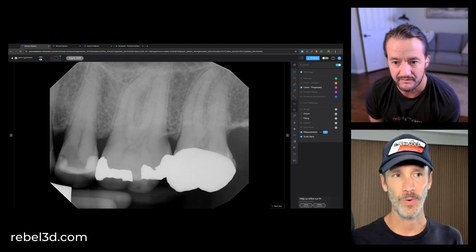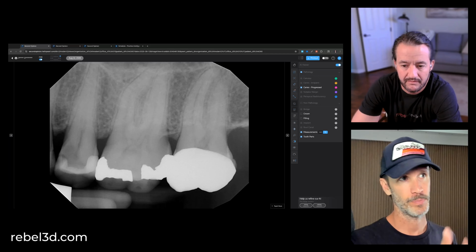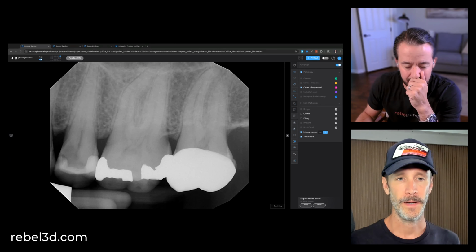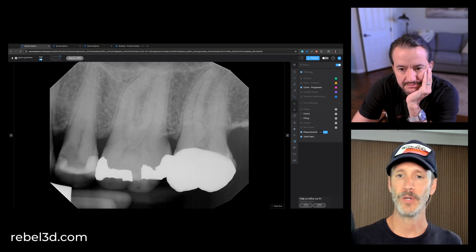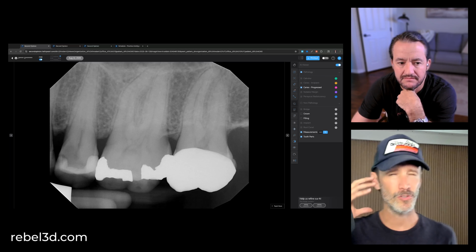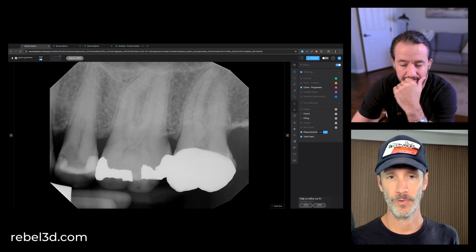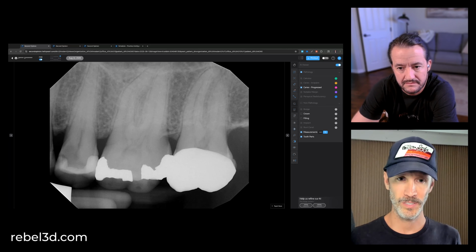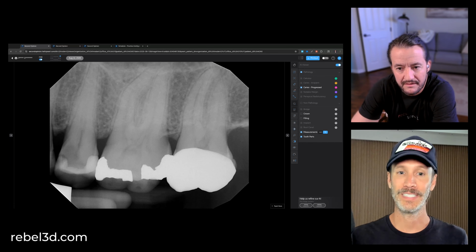And what's funny is when we created Pearl, we started this back in 2015, this specific product called Second Opinion came to the market in about 2021. We really made it for doctors to assist doctors in diagnosis, make sure we're not missing anything. I mean, we doctors have so many decisions to make. We wanted like the easy button on reading radiographs. But all the feedback we were getting was, oh, it's so nice now because I can show it to my patients and my patients can actually see this.